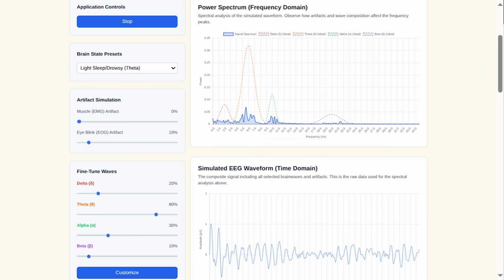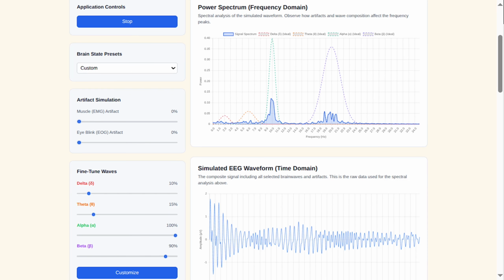What are active electrodes? Active electrodes have built-in amplifiers right at the electrode site. They boost the signal directly on the scalp, reducing noise from cables and environmental interference. This leads to clearer EEG readings, especially in mobile or high-movement environments.